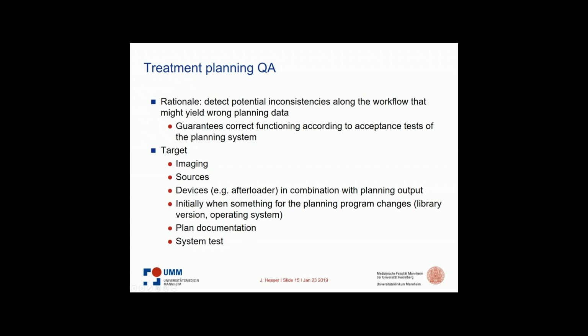When this is done, essentially as part of the planning, then you get a plan. This is documented, and this is important because the documentation tells how much dose distribution, for example, for later re-radiation, we have to know the exact values. This has to be checked, whether the documentation is correct.